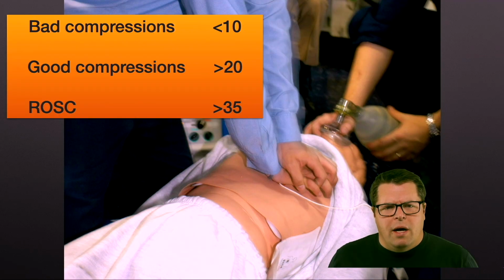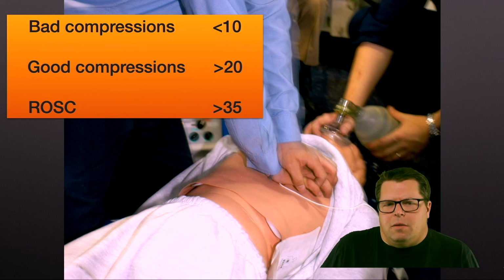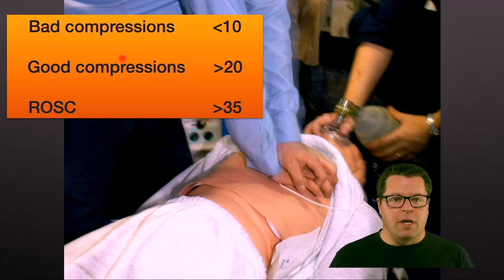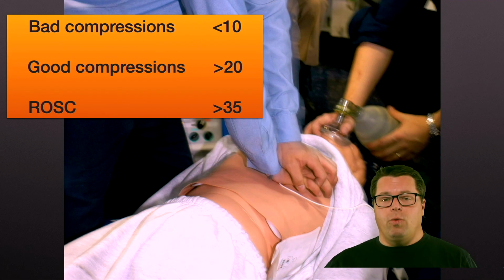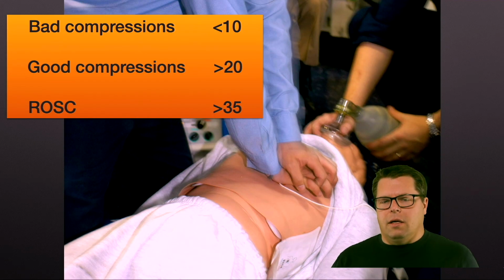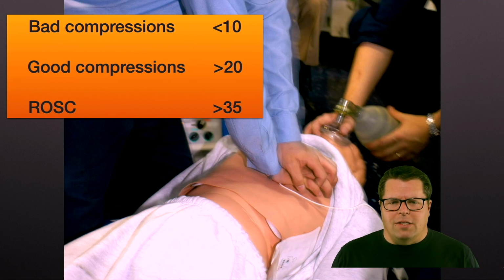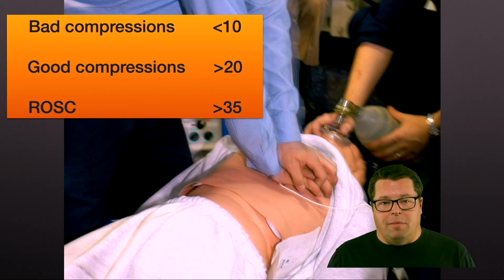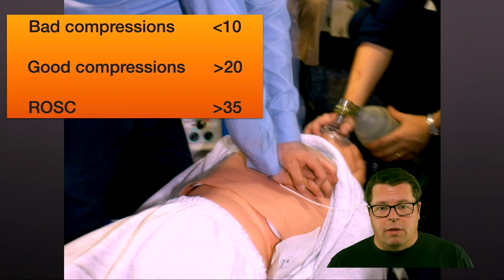But it also is a little bit strange because sometimes you get an end tidal less than 10 because the person's dead. It's not always the compressor itself, but if you were getting end tidals of say 25 and then you switch chest compressors and now all of a sudden it's 8 and the person looks like they're having a hard time, again, clinically it sure looks like probably this chest compression could be better. And yes, if you had a big old increase in end tidal CO2, maybe it's because the patient got ROSC and that's why. So maybe that'd be a good time to stop or at least feel very carefully to make sure you didn't actually have a pulse at your next pulse check.